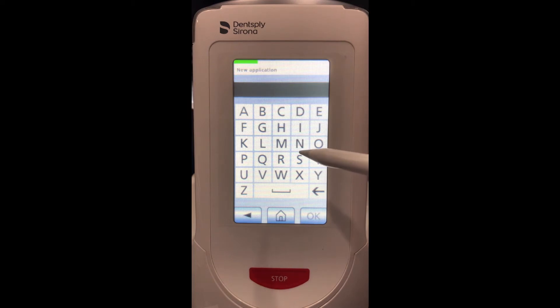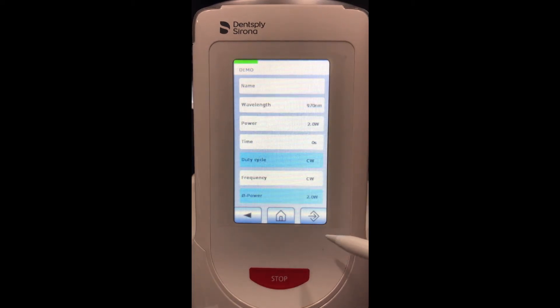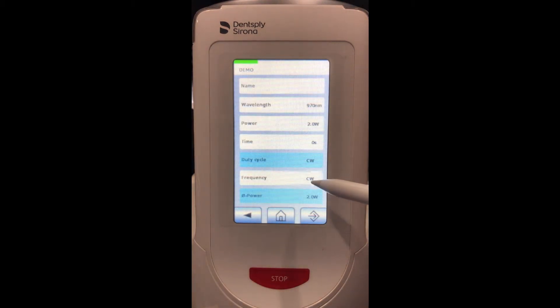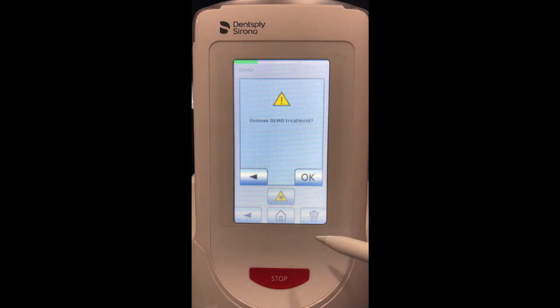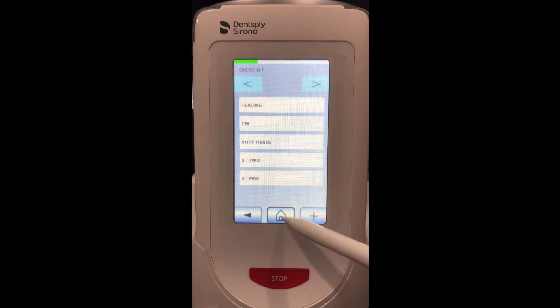To create a custom application, I click the plus button at the bottom right corner, title it whatever I'd like — I'll use 'demo' — and then I can choose which wavelength I'd like to use: 445, 660, frequency, wattage — everything can be changed. Currently it's on 970. Click this button and now it's added under demo. We can also delete it if we'd like.